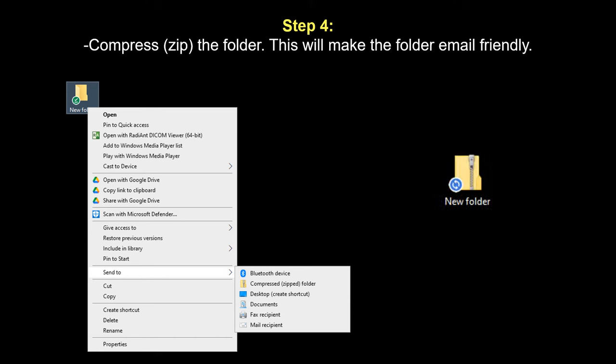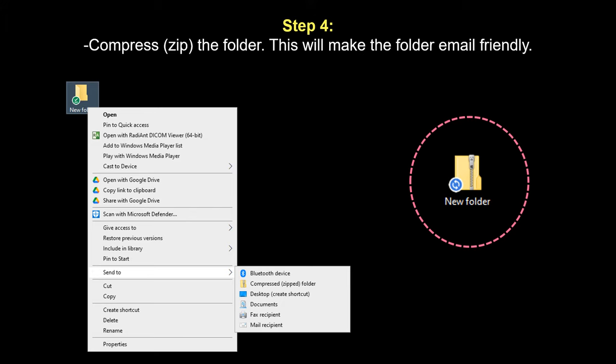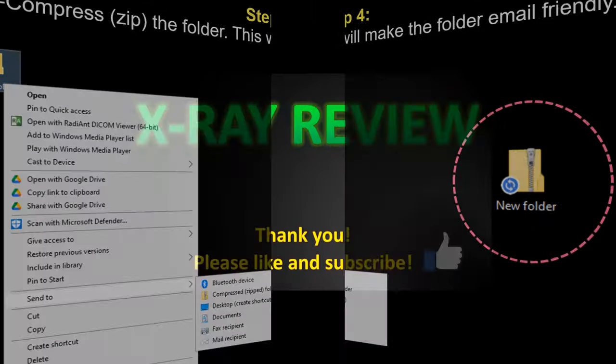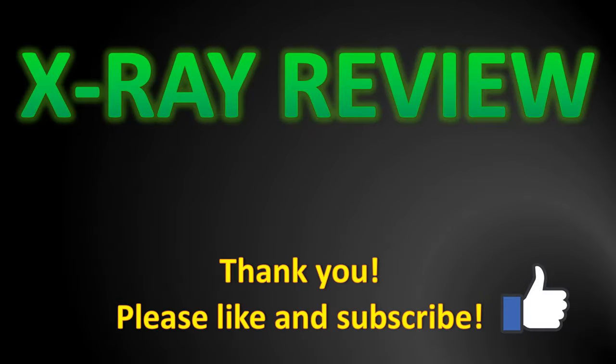You'll see a little zipper going through it, and that indicates the zipped folder. And that will make it more email friendly if you are trying to then securely email this attachment.